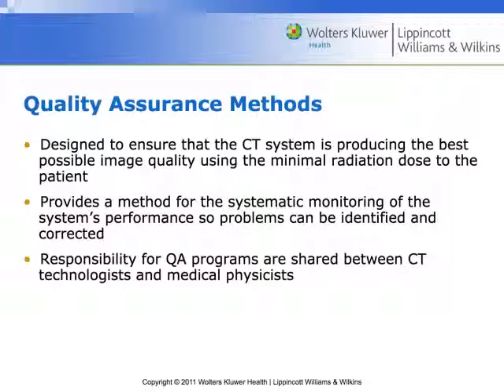Typically in the past, these were kind of vendor specific, so GE would give you a certain kind of QA phantom that was just for use with GE, and you just ran the GE QA program. It was a protocol that came preloaded in the scanner, and you were good. But they're starting to look now at a standardized or universal way of measuring quality. I think the American College of Radiology has released their own separate phantom that's pretty much a universal phantom, and that's how you can get certification from the ACR that your machine is up to universal standards, not just the vendor-specific standards.